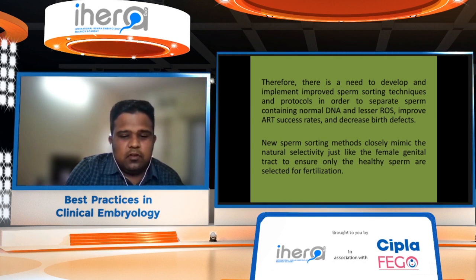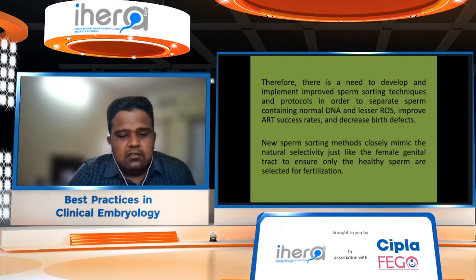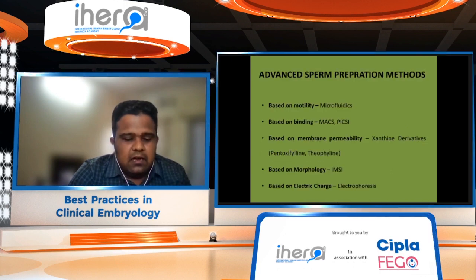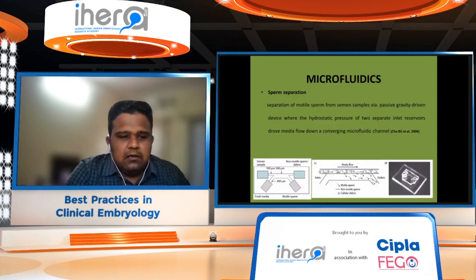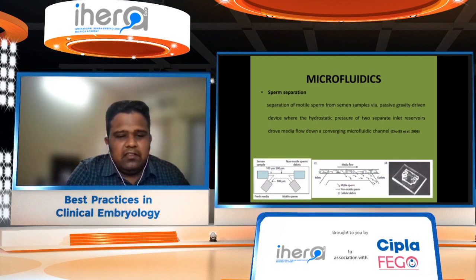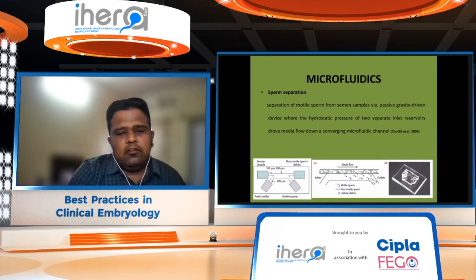These new sperm sorting methods basically mimic natural selectivity, and they are based upon motility, binding, membrane permeability, morphology, and electric charge. But we'll be majorly discussing microfluidics and MACS. So microfluidics is basically a technique to separate motile spermatozoa via a gravity-driven device with hydrostatic pressure, with inlet reservoirs driving flow down a converging microfluidic channel.